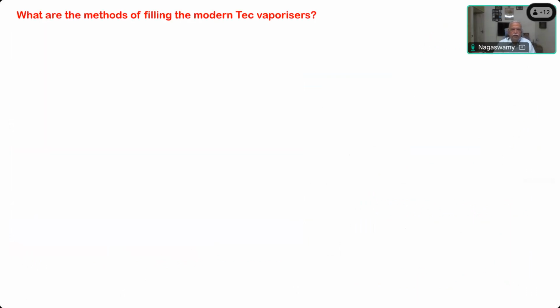Now, there are different methods of filling the modern Tec vaporizers. This is a common question that is asked in the examination. So, what are all the methods you know of, or you have seen in your day-to-day practice? Key filling, sir. Pour filling.